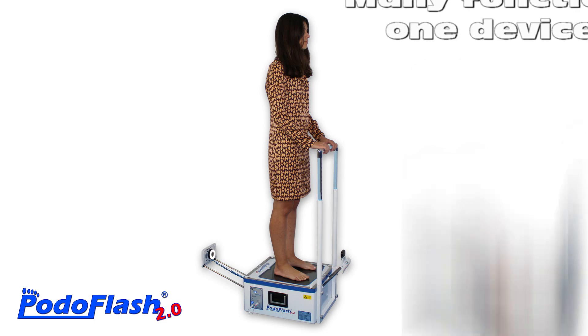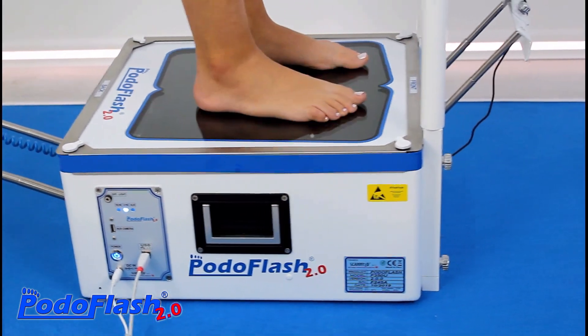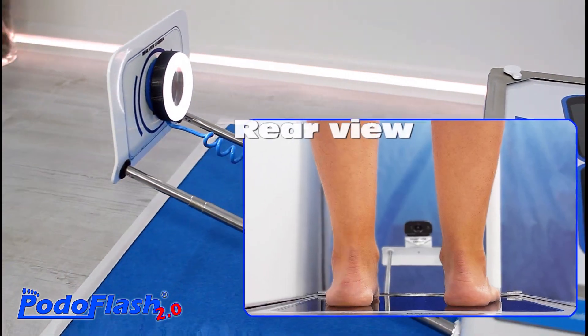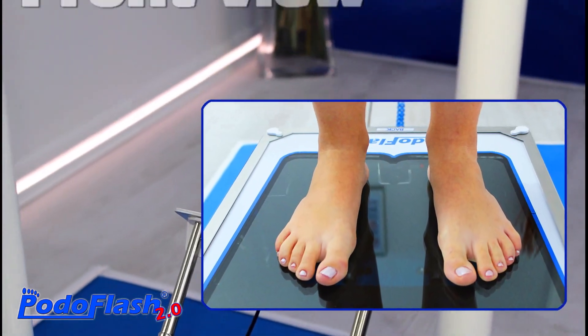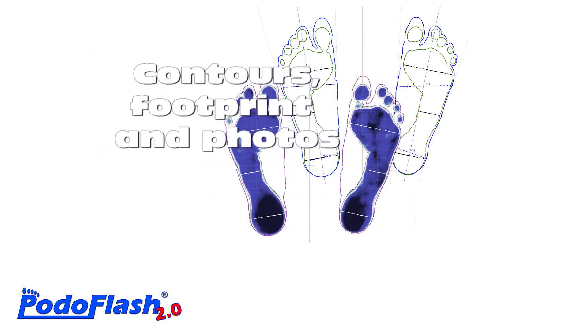Podoflash is a device that embodies many features. The rear view and the front view camera allow to evaluate pronation or supination of the foot and the hallux valgus, while the lower camera is essential to measure the geometric characteristics of the plantar foot shape.